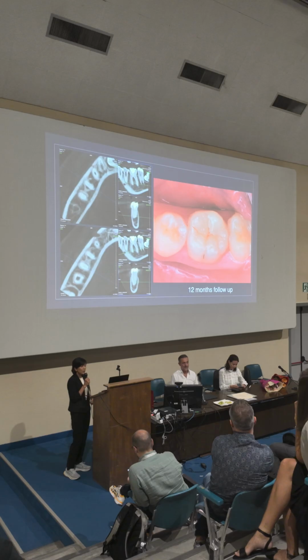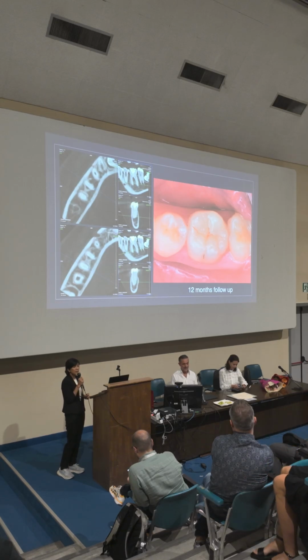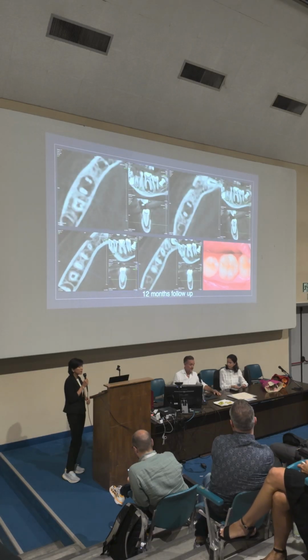And this is the 3-month and 6-month finding on CBCT. And this is the 12-month follow-up. And in this image, you can see the complete healing of the periapical lesion. You can compare the preoperative and 12-month follow-up of this tooth.